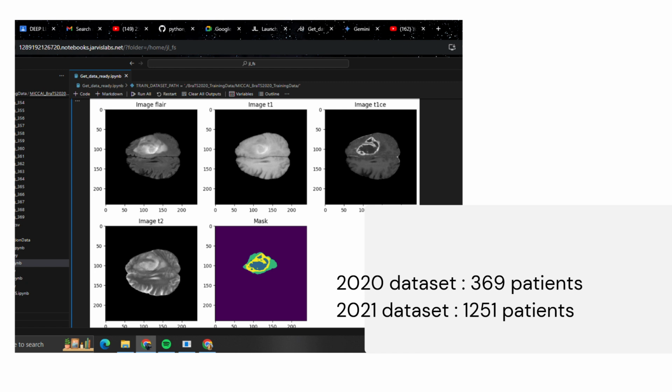For the further training process, we won't be using the T1 because as we can see, the tumor is extremely light in T1, and while training this will not lead to any increase in accuracy, and it will lead to reduction in efficiency of the GPU.